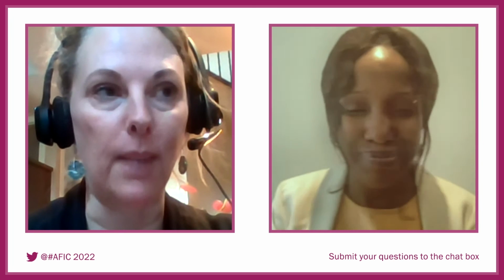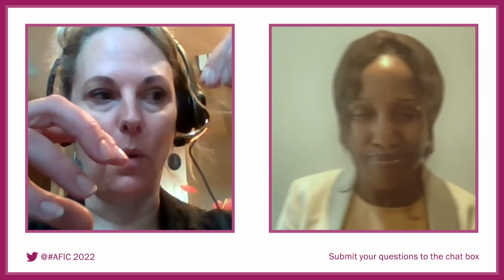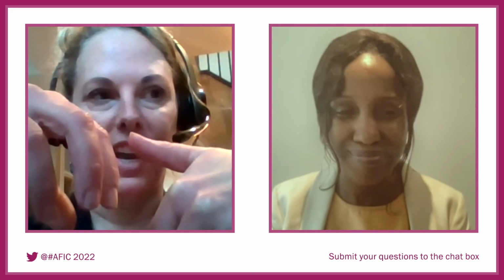Okay. And the last question we have here is, how can twin 1 and 2 switch? Yeah, so it's less common with dichorionic twins for sure. In monochorionic twins, you can see it if they're both close together and you've got 2 heads, for example, or maybe you've got a head and feet. It's not necessarily that they're switching, it's about which parts are the lowest. So if you've got a head here and we're calling baby A the one that's head first, but then baby B is here with their feet, let's say it's footling breech, and then they push their feet down, now this is the presenting twin, even though that's baby 2, if that makes sense.